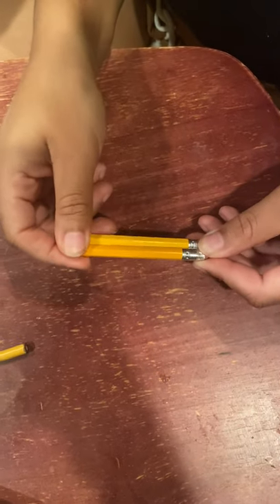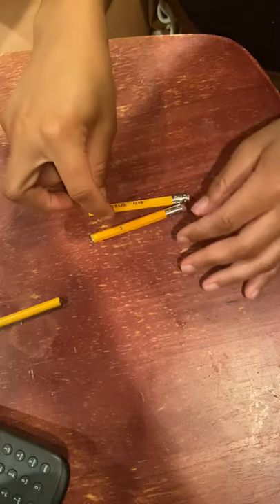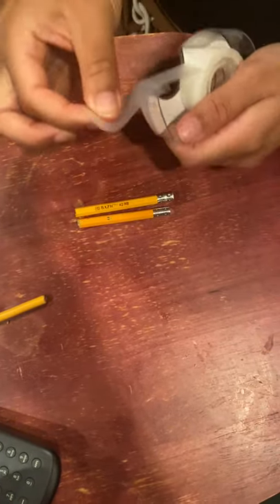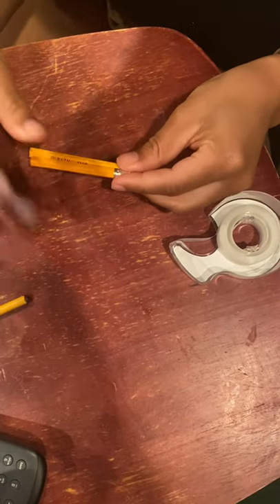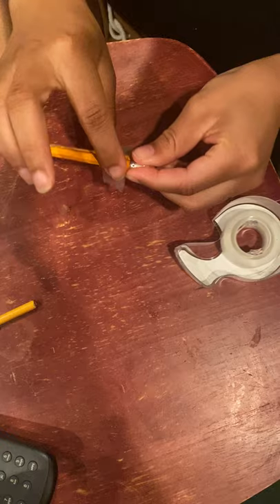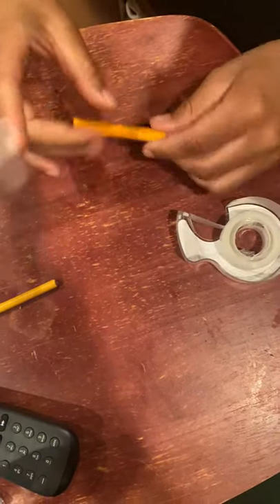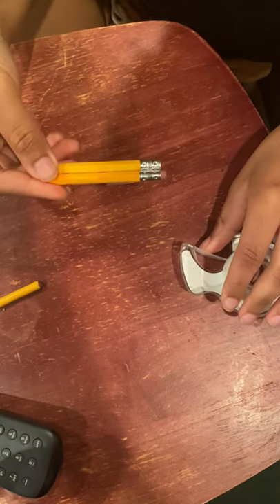Today I'm going to be making a splint for my finger. I have the ends of two pencils. I'm just going to take some tape and tape those together — that's one piece, that's two pieces like that.